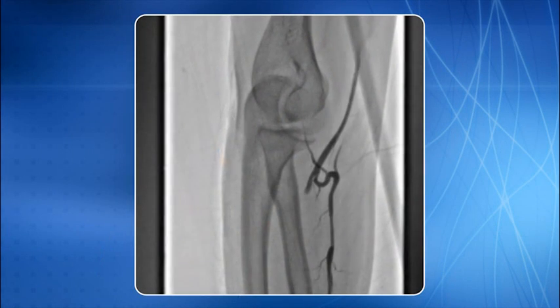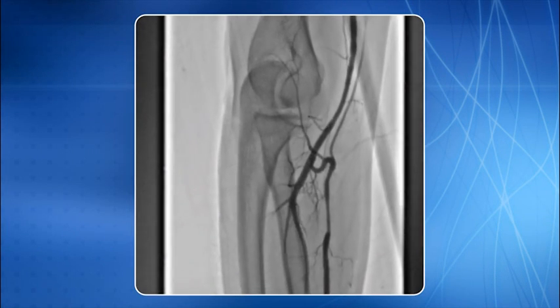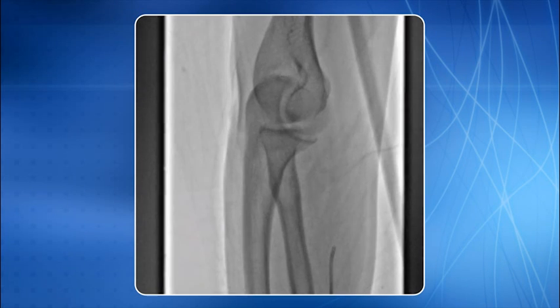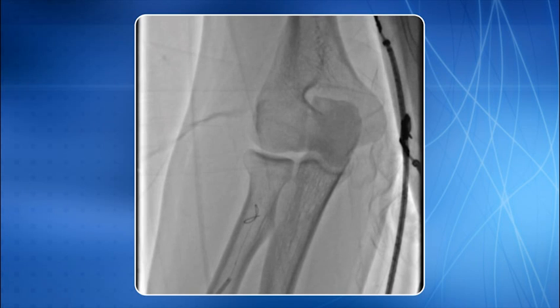It is important to understand that the spasm occurred because of the repeated push of the catheter and the wire against the hairpin loop. If you miss this loop in this situation, you will end up with failure to perform the procedure. So, whenever you are in doubt, it is a good idea to consider taking several views of this region, and you have the answer for your problem. A 0.014-inch soft tip PTCA guide wire was then negotiated across the loop.